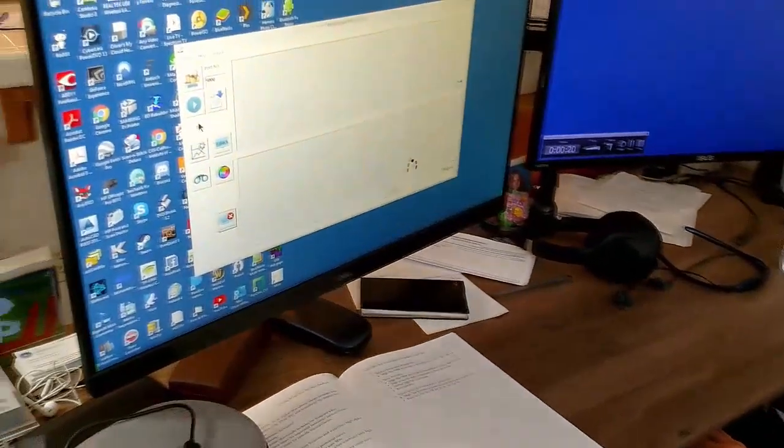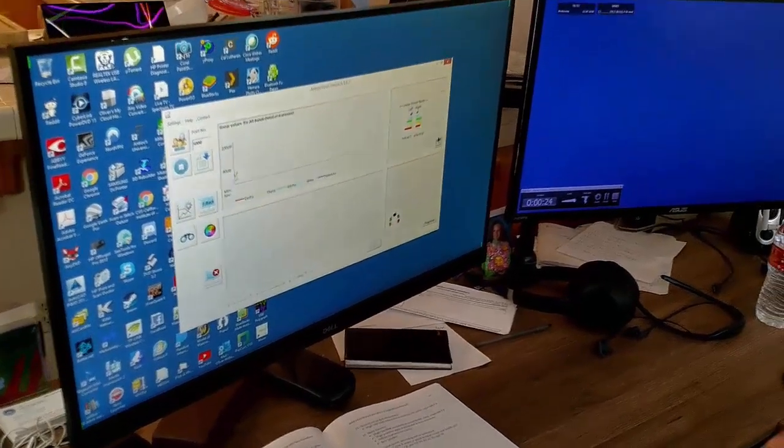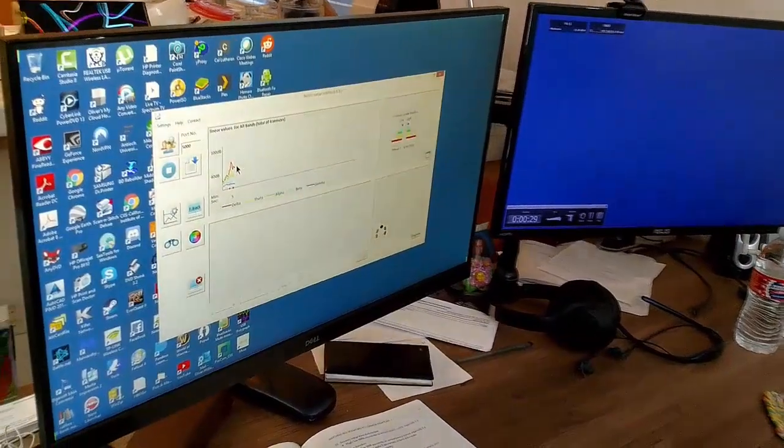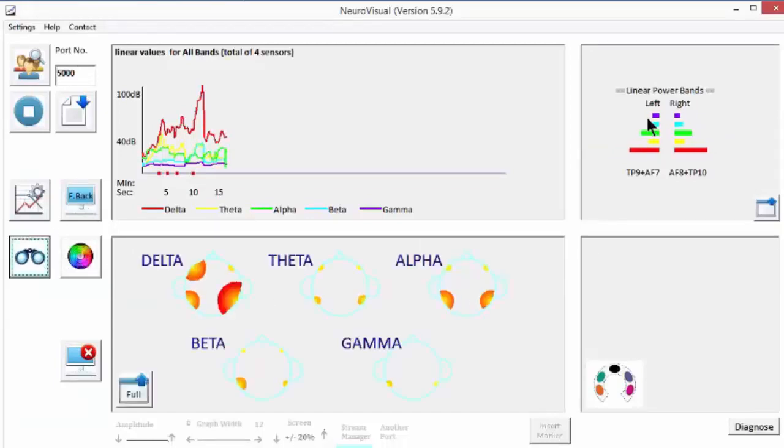And if I press the streaming button, you're going to see the stream from here as well. And we are, of course, recording this, but you can get all kinds of interesting images here. For example, on the screen, I've got here not only the actual EEG band.